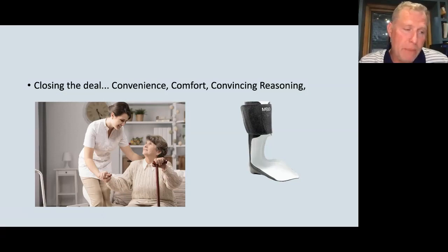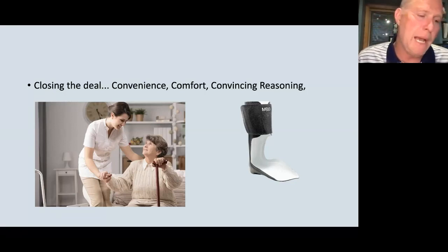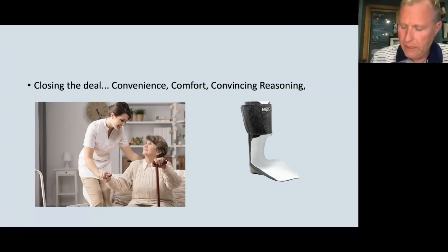One way that I make it easy for them is I make sure they don't have to come back for multiple visits. I'm not saying it's wrong to have them come back in to get scanned or casted. I will tell you that for a senior that's being, in many cases, driven by a family member or whatever, having them have to come back, you will have a fairly large percentage of them that don't come back. So I make it easy for them from the standpoint of fitting and of course shoeing, and then making sure that we cast them effectively as quick as we can.